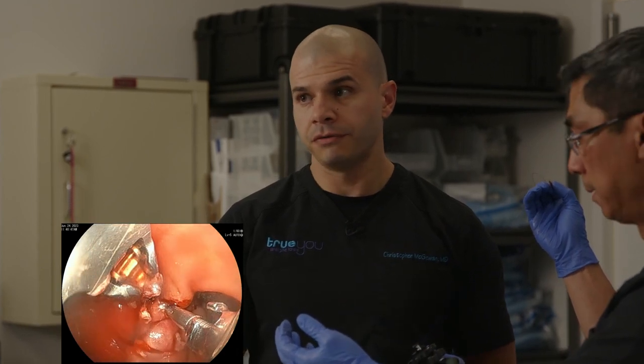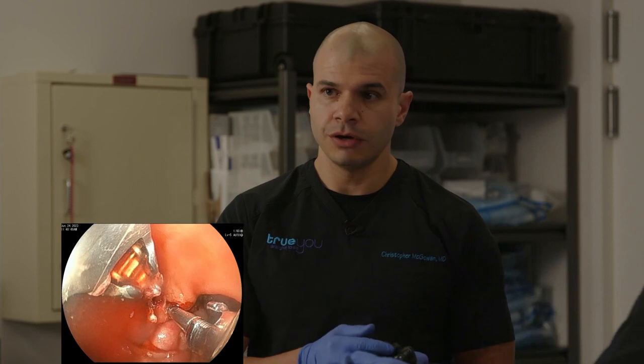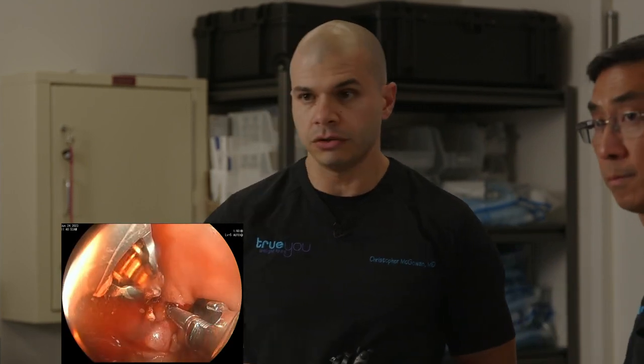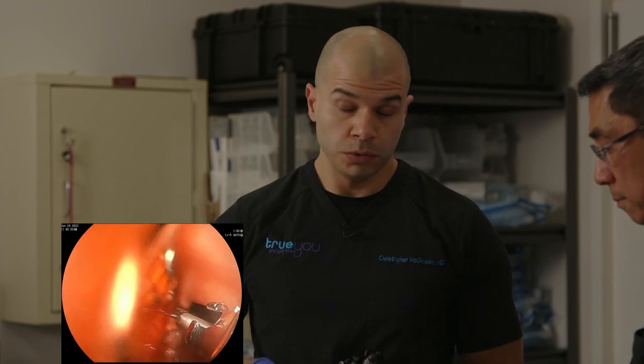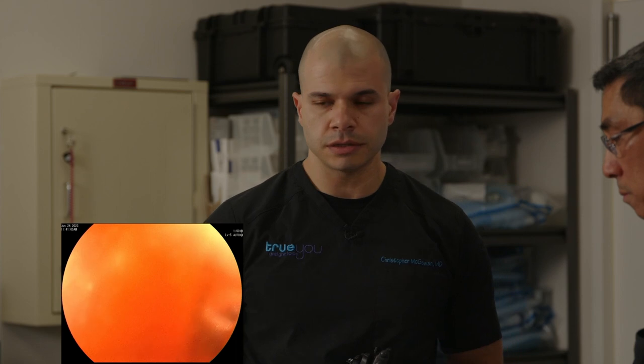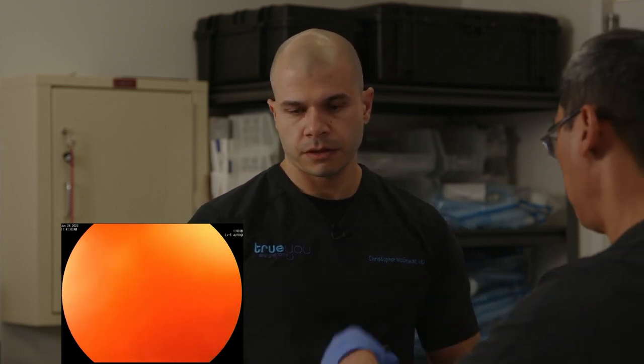We're talking about a revision, and we're talking about a patient who we need to provide the maximum amount of support for. And if that includes procedure plus medications, we'll do anything that we need to do, anything possible to help. So I'm cinching this suture, and then we'll have one more suture after this. So we're coming down the home stretch here, just a few minutes left in this procedure. Go ahead and cinch. Okay.